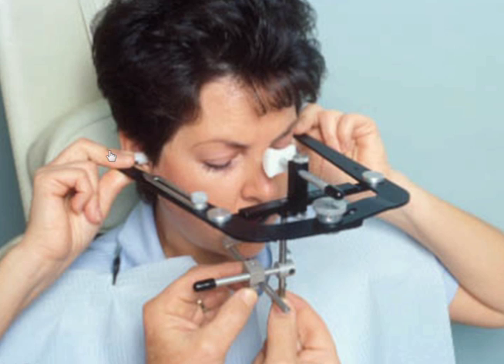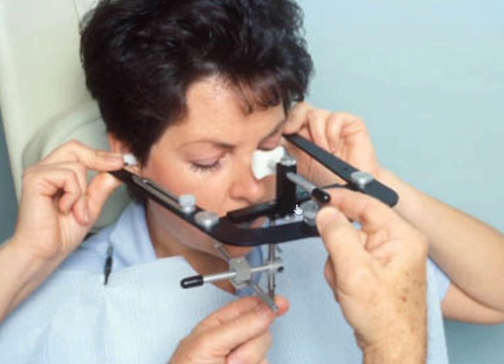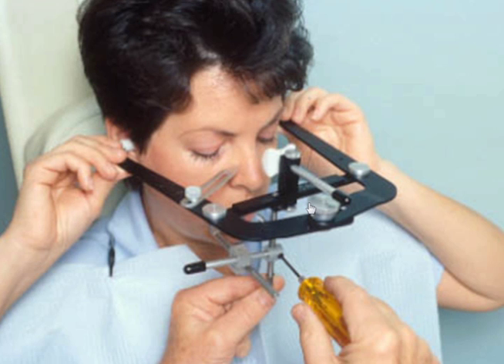And then once they get into their ears, we can go ahead and tighten the large screw here in the front. Now, most Facebow systems use only an orbital pointer, where you would measure either from nasion down, or you'd feel where the lower border of the eye is here and come over and put a spot on the nose, or they sometimes take a ruler measurement from the teeth and make a spot on the nose. And then we can raise and lower the front of the Facebow until the orbital pointer is at the same height as the spot on the nose.